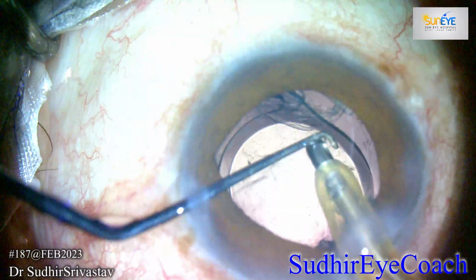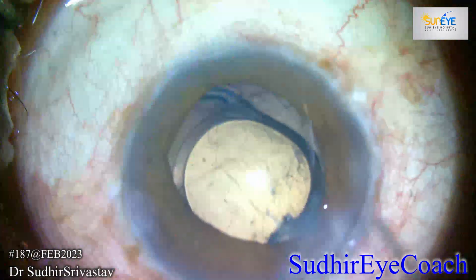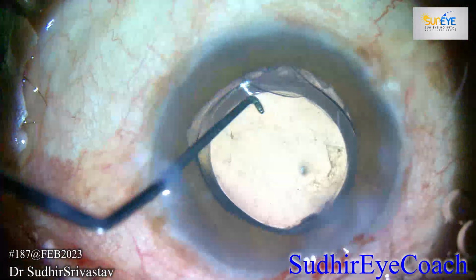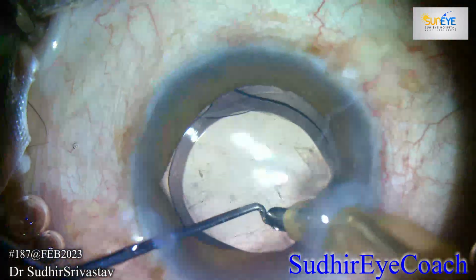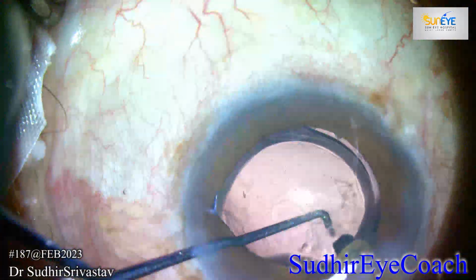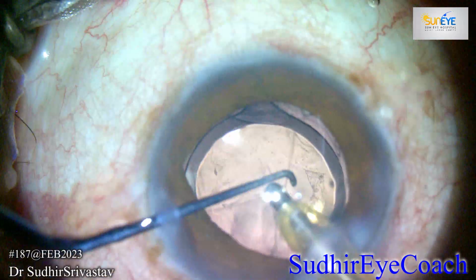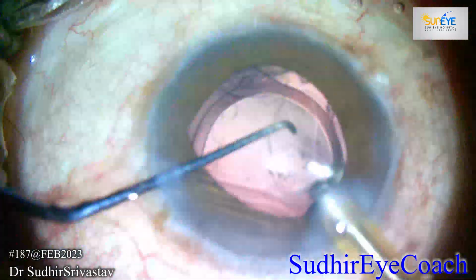I knew that I would go very near to the dehiscence area, and if I tried to remove the cortex there, I could catch hold of the vitreous strand, and it happened. The IA tip dragged a vitreous strand, but fortunately there was not much vitreous movement forward. Then I removed the cortex which was in the subincisional area. You can see the vitreous strands coming to the IA tip.